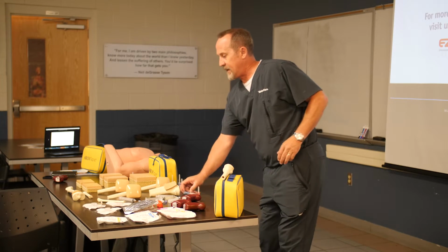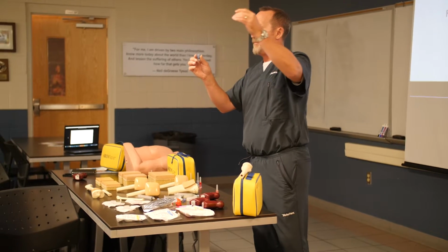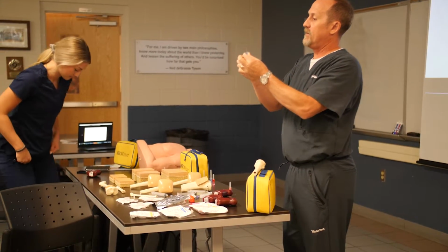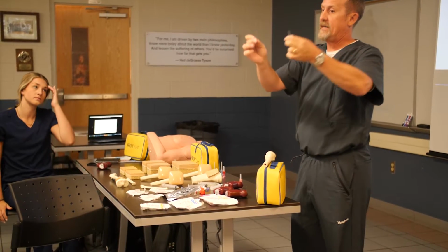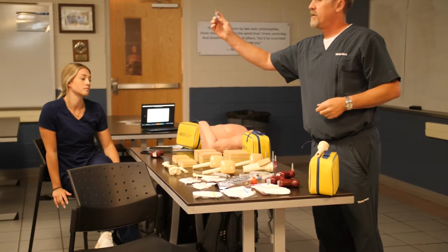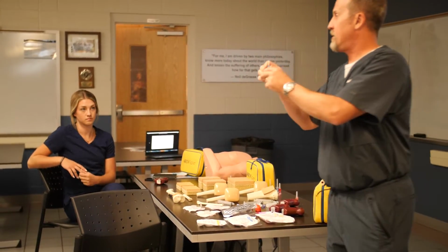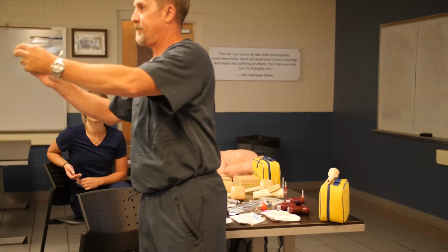I call it a needle set, and I'm very specific about that for a reason, because it is a set. It has a cap, it has a stylet, and it also has a catheter. So it's a 3-part device. Very important to remember, but if you take the needle cap off, you look, the actual catheter has black lines around it. The stylet does not have any black lines on it.